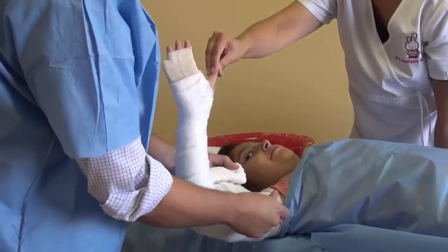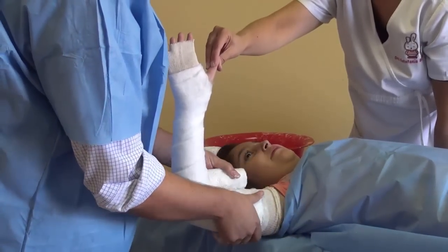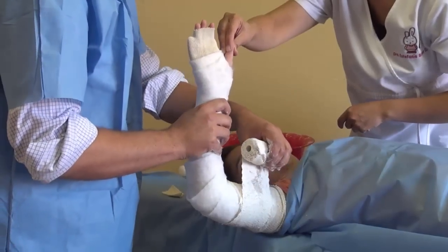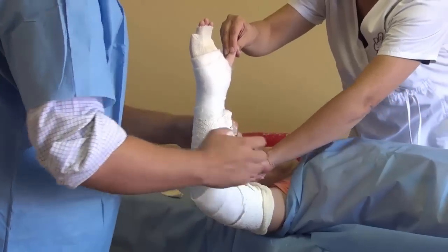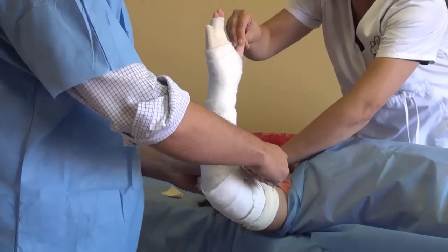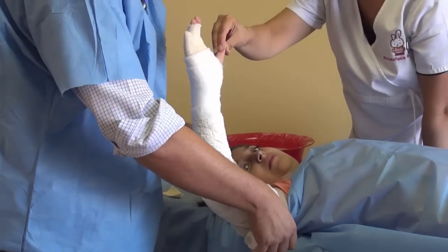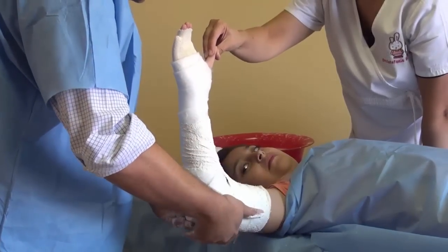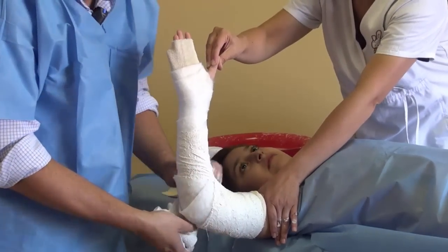Now we're going to start up here. Two whole turns. Make sure to have the right tension — not too tight, not too loose. And now we cross over to the forearm, protecting the soft structures that cross on the other side of the elbow, and go back up. We protect this, and now we cover it. Make sure the cast rolls over itself. Do not lift it — just make it roll.